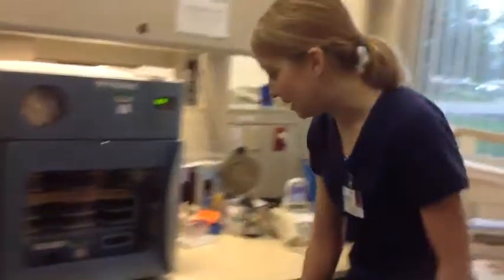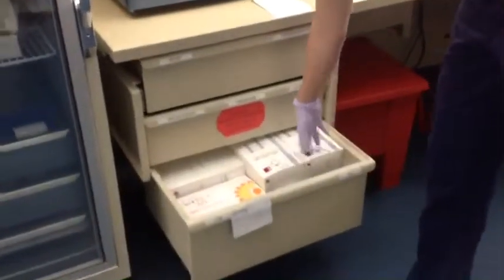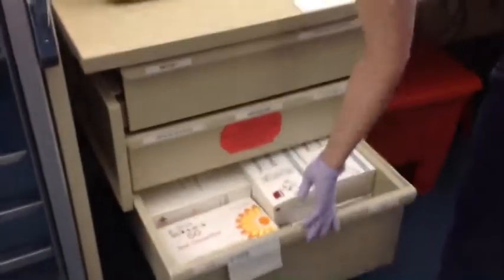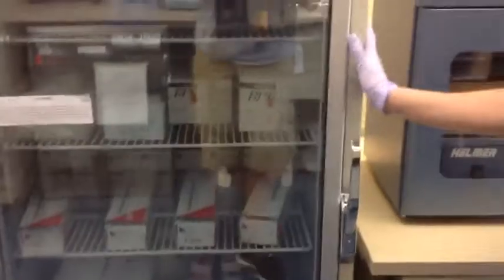Over here is immunology. This is where we do our kit testing. We do pregnancy tests. We do fecal occult blood, which tests for blood in the stool specimens. We do HIVs, monos, and we also do syphilis testing over here.